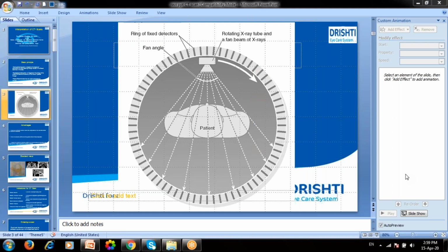Okay. So benign and malignant cannot be distinguished in a single scan, right? So while examining any patient, you need to start from the history part, right? You have to take the history of since when the mass has been there. Like since 1 year, 2 years, 3 years. So the history is the first thing to keep in your mind: what history the patient is giving for that mass.